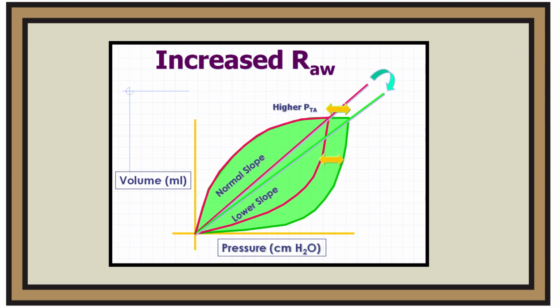An increase in the airway resistance is associated with abnormal widening of the respiratory tracings. Patients with obstructive disorders exhibit a wide pressure volume loop. This abnormal widening of the shape of the pressure volume loop is referred to as increased hysteresis.